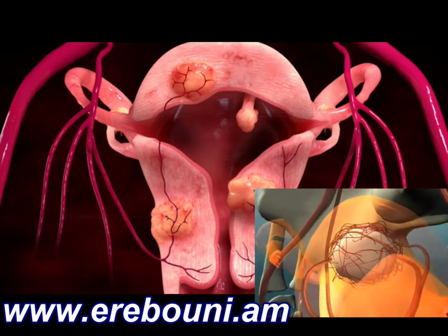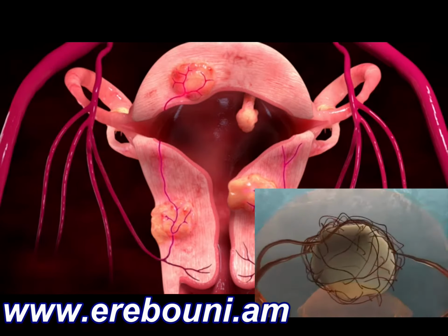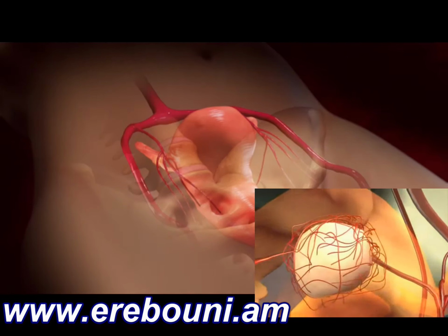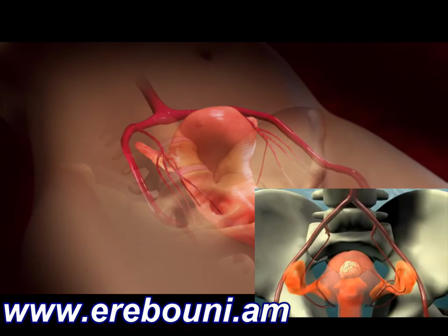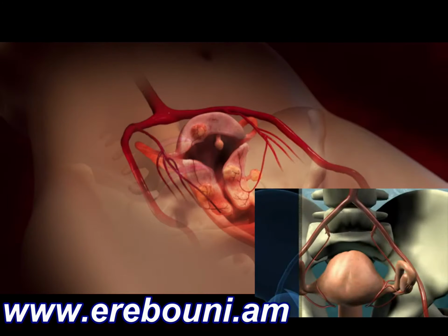All fibroids require a supply of blood to survive and grow. UFE takes advantage of this fact to target the fibroids. Uterine fibroid embolization is a minimally invasive procedure. UFE does not remove the uterus or the ovaries.